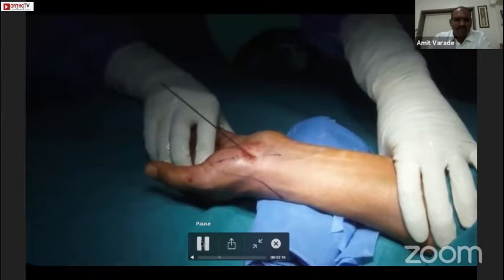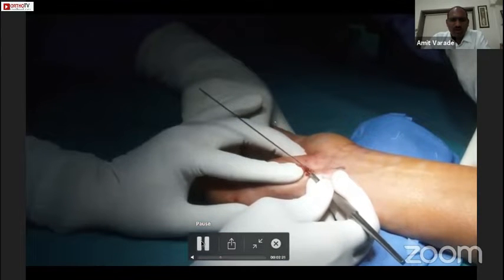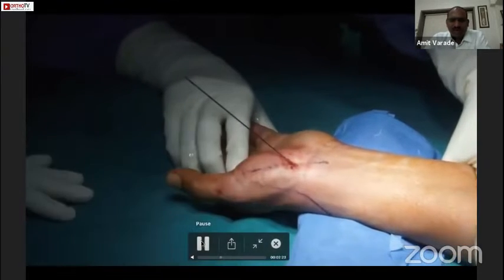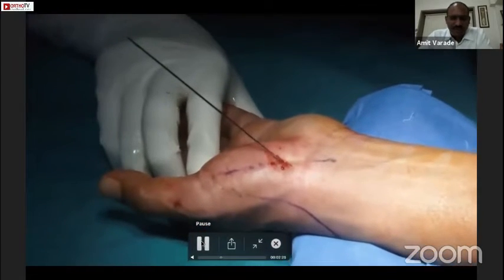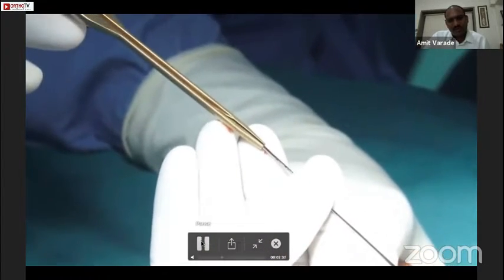After this, we gently remove the needle. Now we have to measure the size of the screw required for fixation. I have extended the incision a bit, and now we are using the direct measuring device, which we pass over the guide wire.